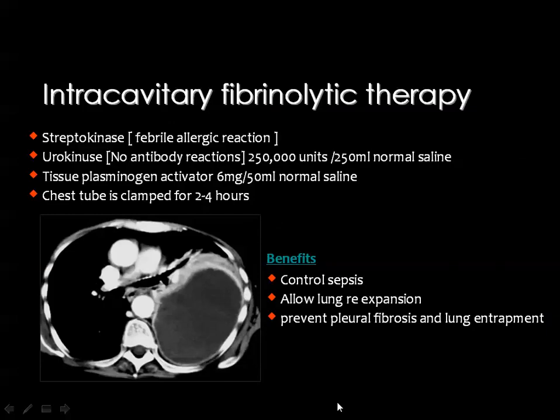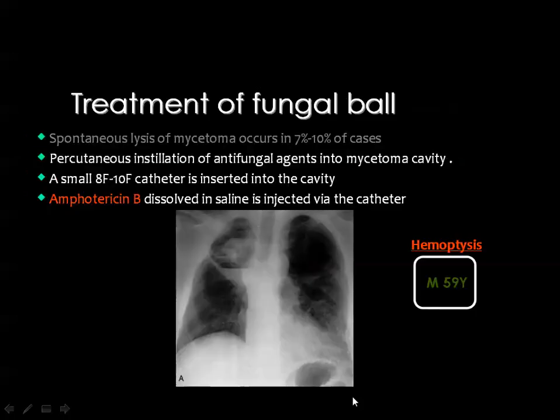Then this is good for recent pleural collections, which have not yet developed fibrosis or loculation or septations inside the collection itself. If so, and you are draining a collection which is relatively old, then you may have to inject some fibrinolytic materials like streptokinase or others in order to remove some of the fibrotic bands to ensure adequate drainage.